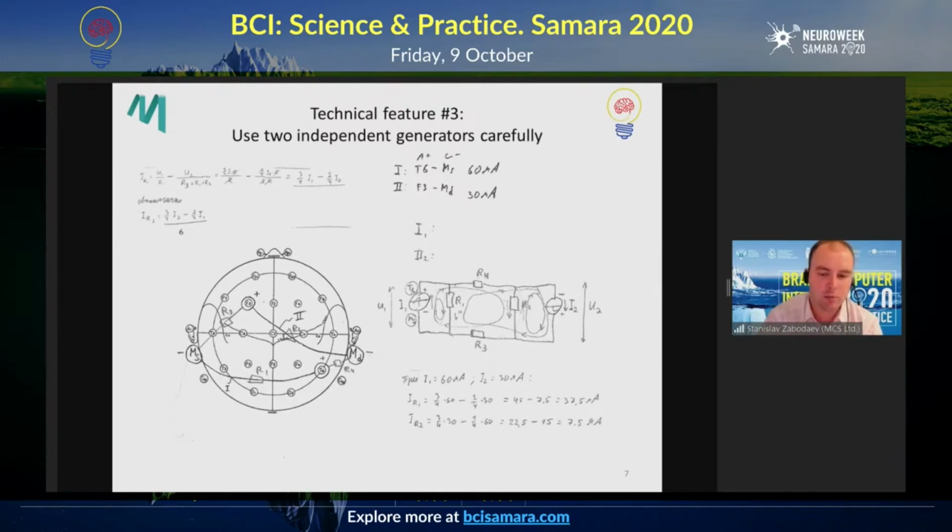So the anode-cathode connection might lead to a situation when the stimulation will either worsen, as in this example that you see on the screen.